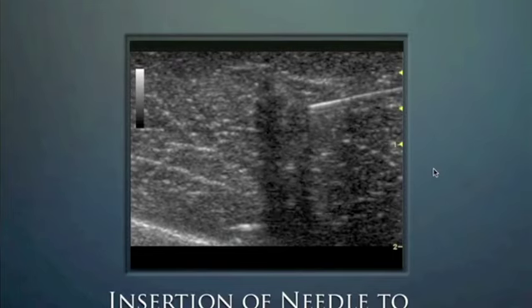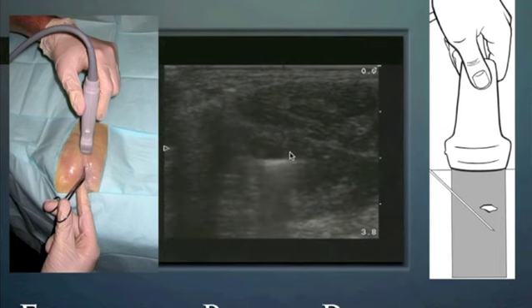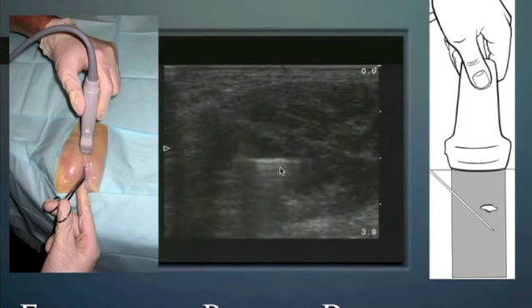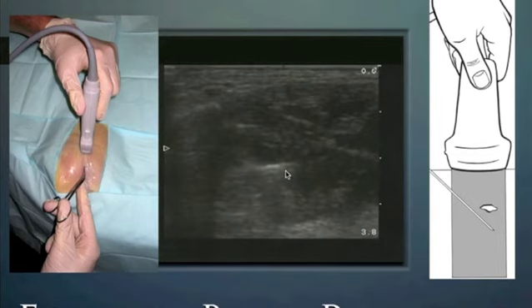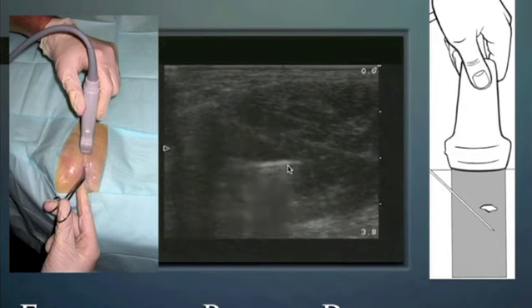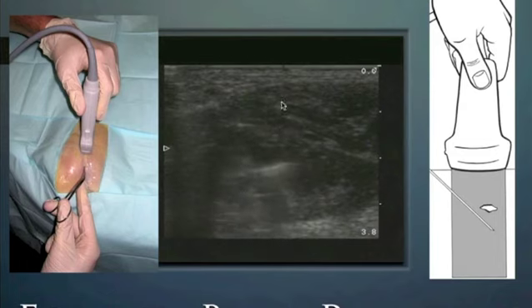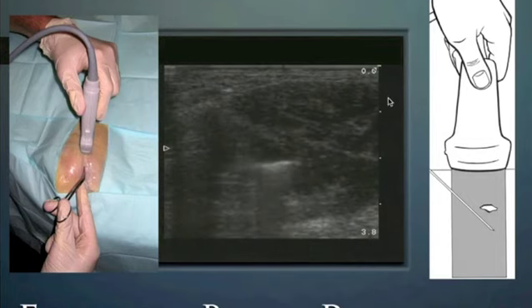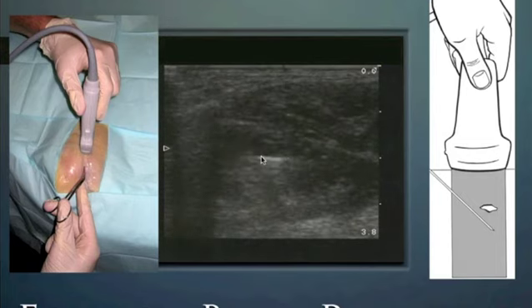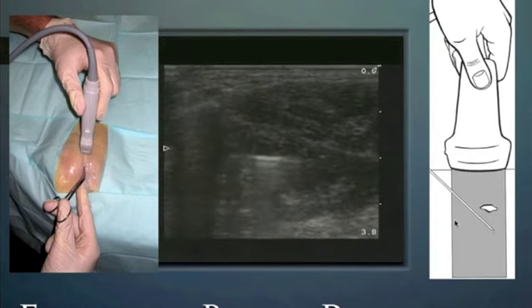This patient had a needle break off in their buttocks during an immunization years ago, and they came in because it was particularly discomforting on that particular day. And when they arrived, we took a look with ultrasound and found this needle about 2 centimeters. These are 1 centimeter hash marks. So we get down to about 2 centimeters below the skin line, and we guided a needle down to the foreign object, placed a guide wire through the needle, and then we removed the needle, and then we did blunt dissection down the edge of the guide wire with our grasper until we were able to come in contact with it, in which case we extracted the foreign body.